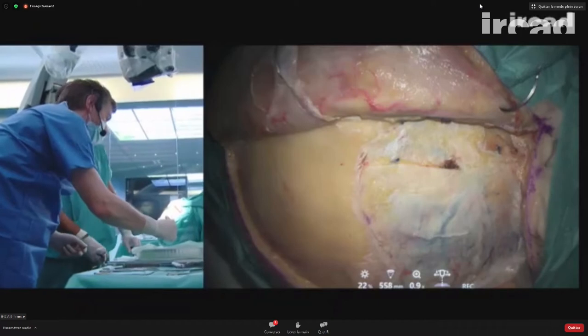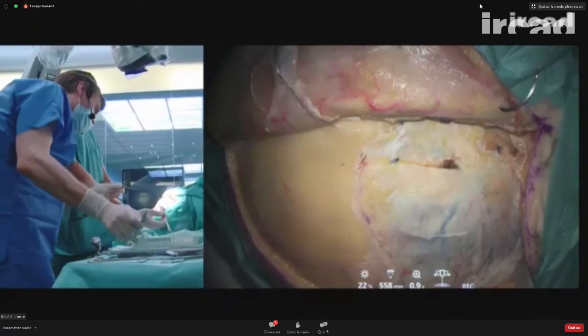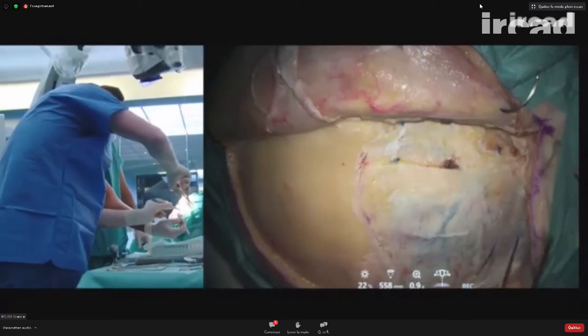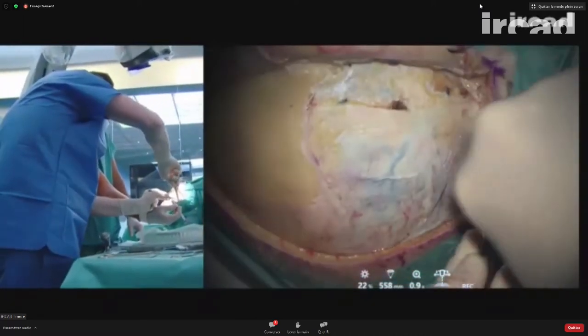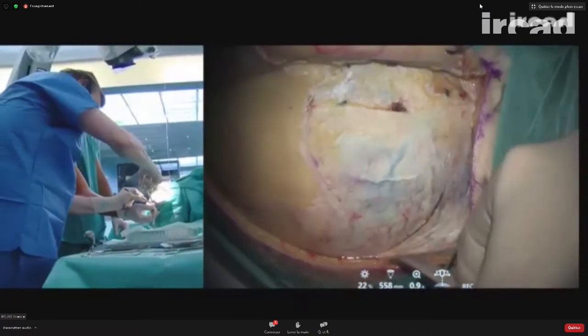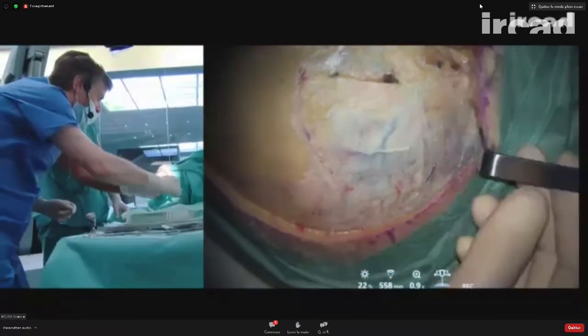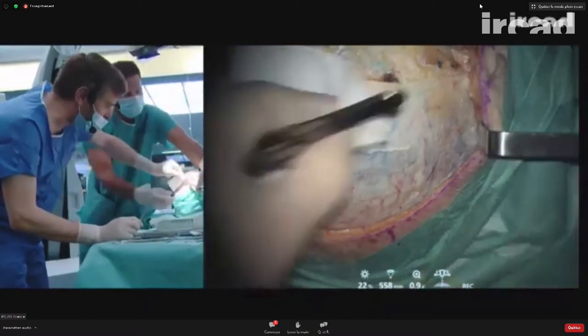Okay, now let's work on the muscle. Working on the muscle is extremely important to have a proper mobilization of the temporalis muscle in order to avoid any injury to the muscle and postoperative temporalis muscle atrophy.